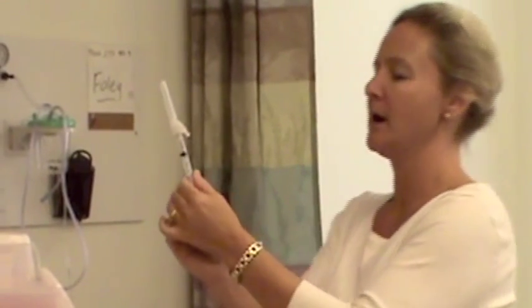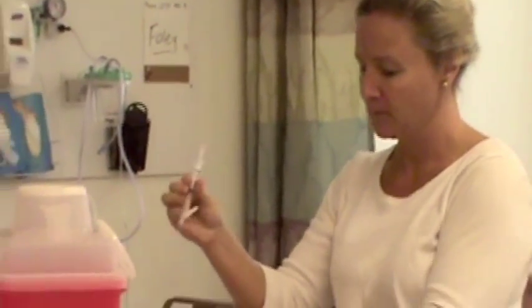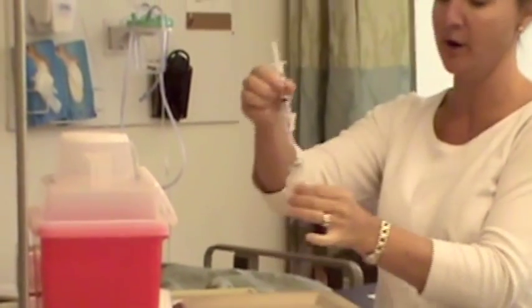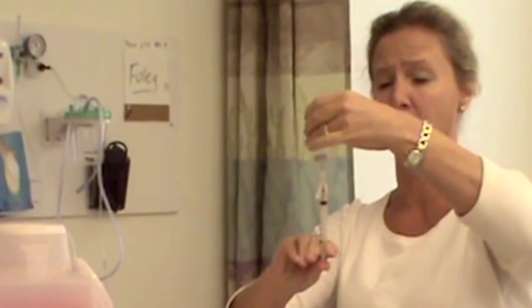Okay, and then I'm going to pull up, because I said it is 200 milligrams per 1 ml, I am going to pull up 1 milliliter of air. I'm going to take off my cap, and I'm going to inject the 1 milliliter of air into the vial, air into air. And then I'm going to turn over my vial, making sure that the needle is in the solution, otherwise I'll just be drawing up air.